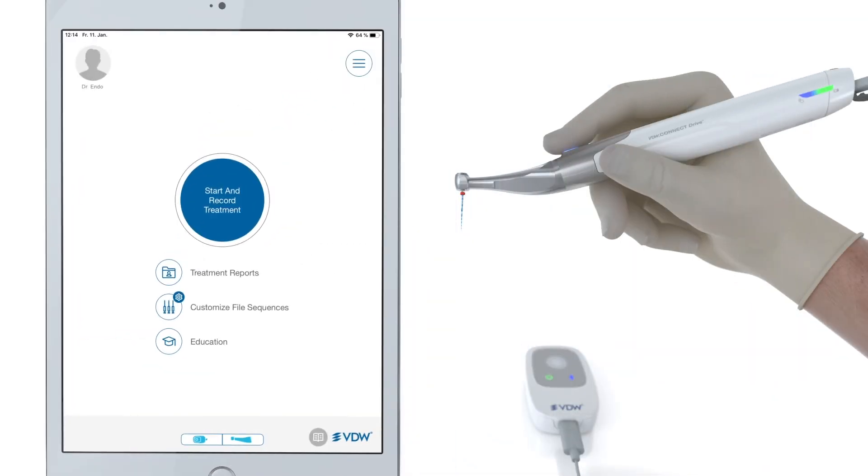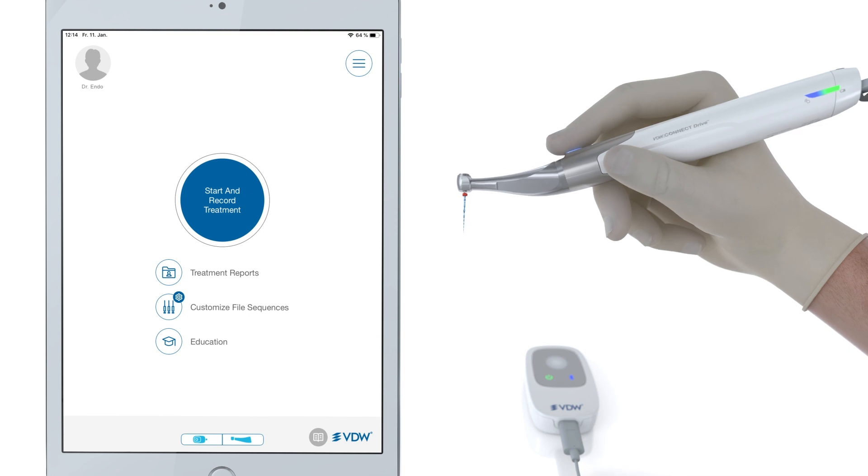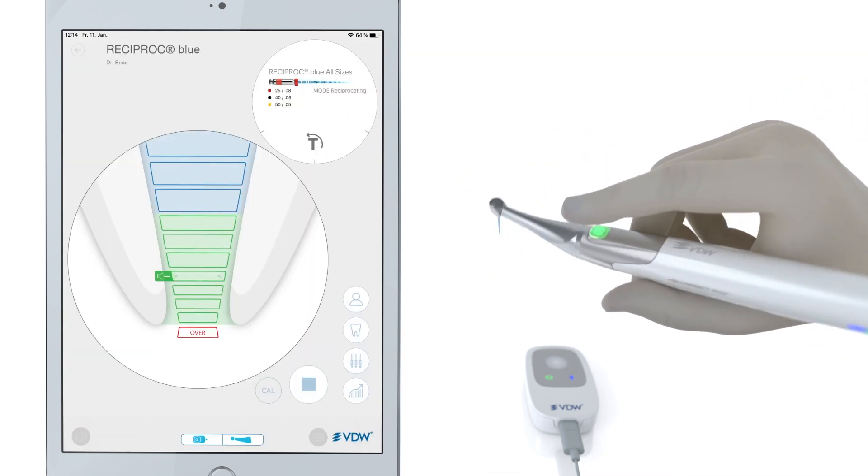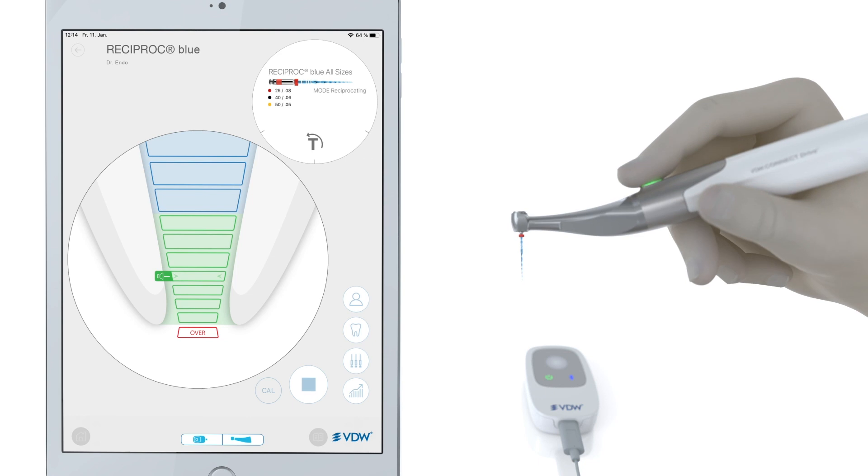Now you're ready to perform an endo treatment. First, turn on the handpiece with the button below the contra angle. Then you will see the app screen change to the execution screen. There you'll see two bubbles. The bigger one contains apical information. The smaller one indicates the file you've chosen to work with and the torque you want to apply.